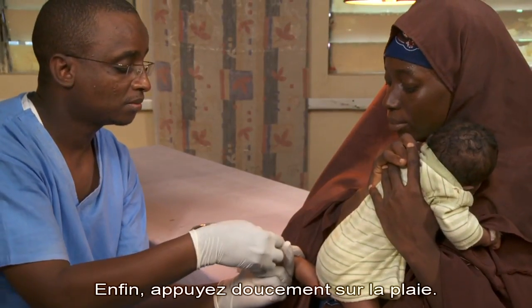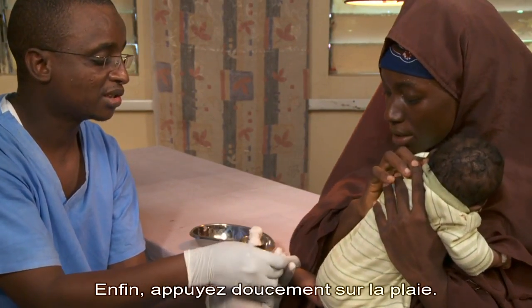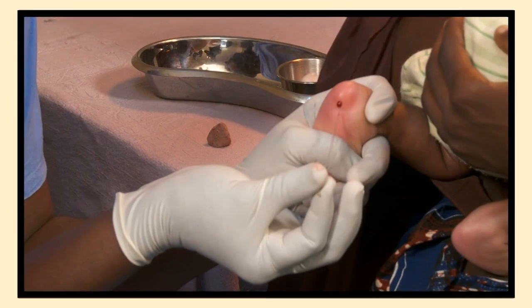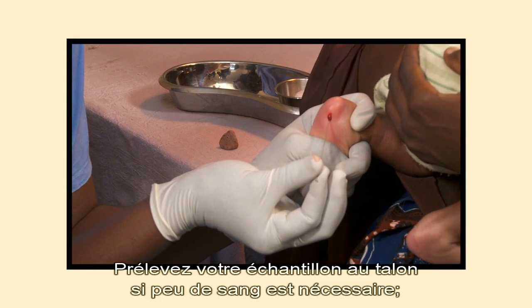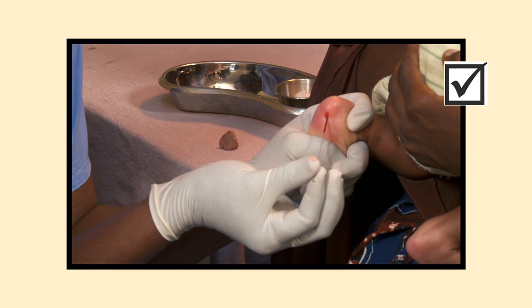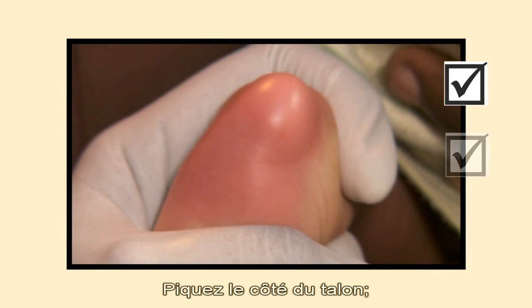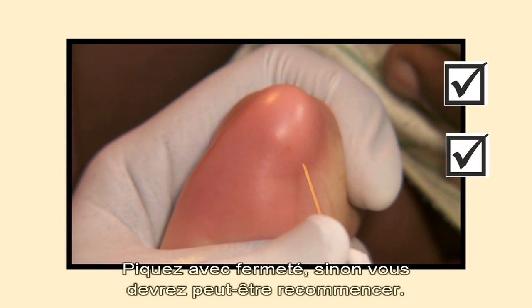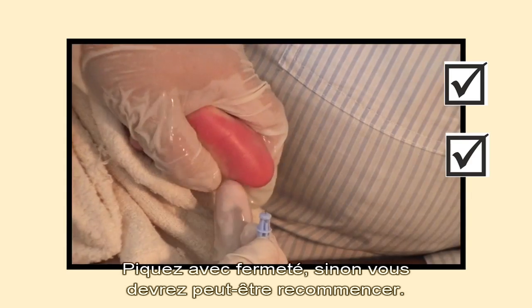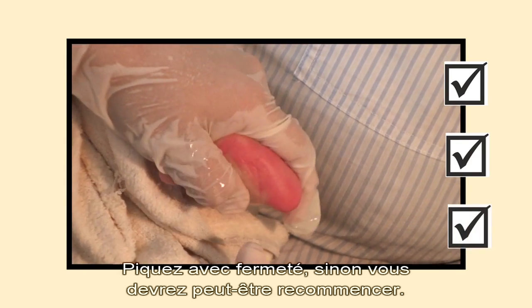When done, apply gentle pressure over the puncture site. Remember: use a heel sample when only a small amount of blood is needed. Use the side of the heel. Puncture firmly — if you jab too gently, you may need to jab again.